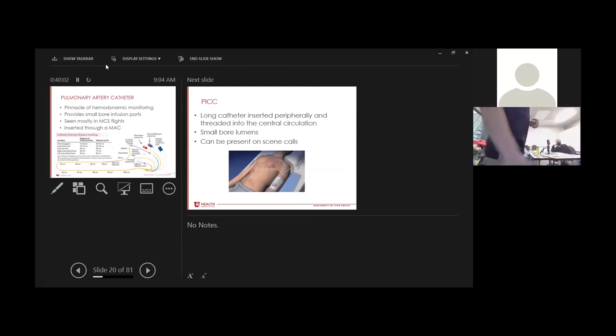All right, one of the goals today is to talk about hemodynamic monitoring. This is your pulmonary artery catheter. Maybe something you're familiar with. Ryan, have you ever seen one of these before? I've only studied it. I've never had a patient. You do part of your FPC, a Swan, hemodynamics, states of shock, correct? I've studied and tested, but I've never put my hands on it.